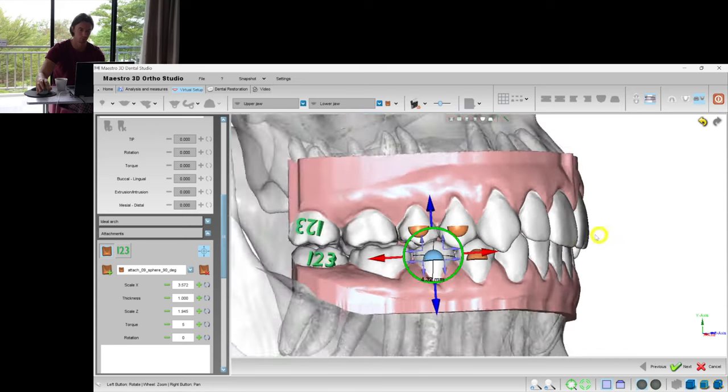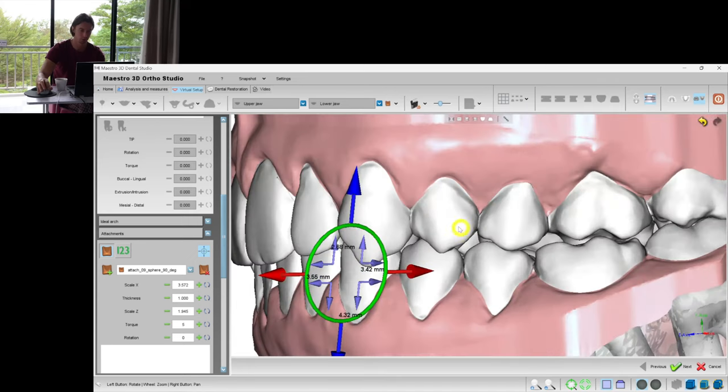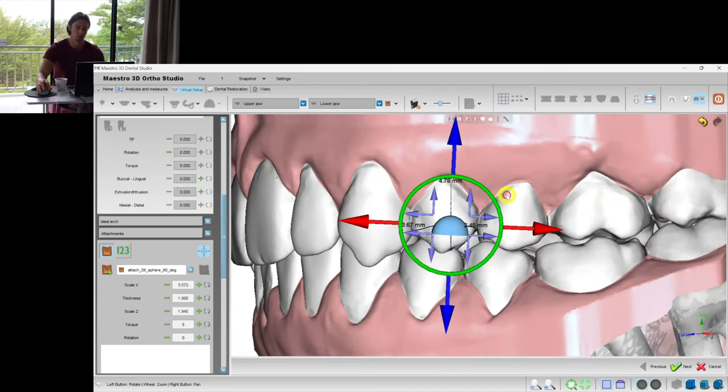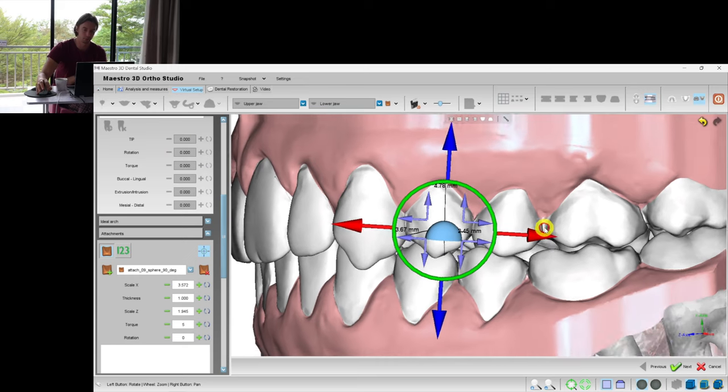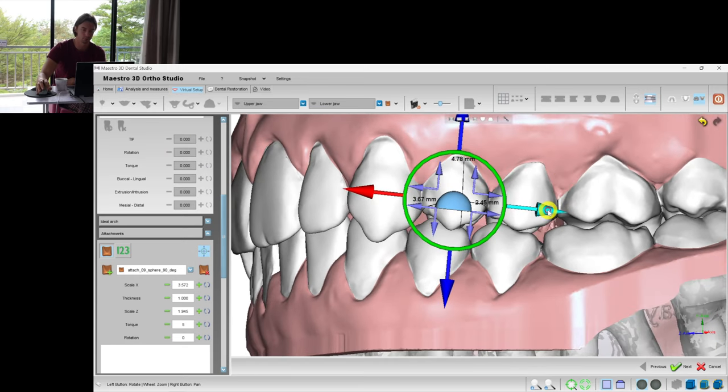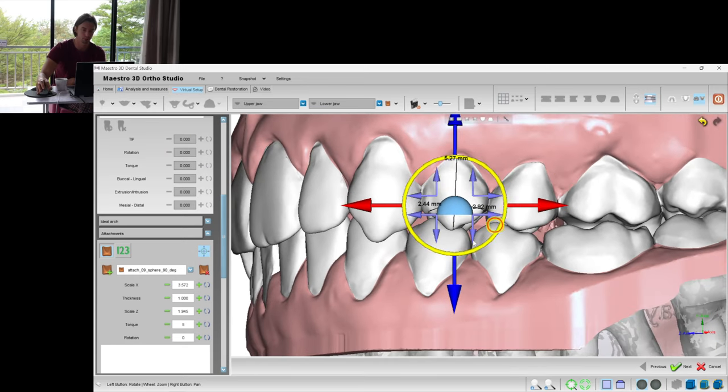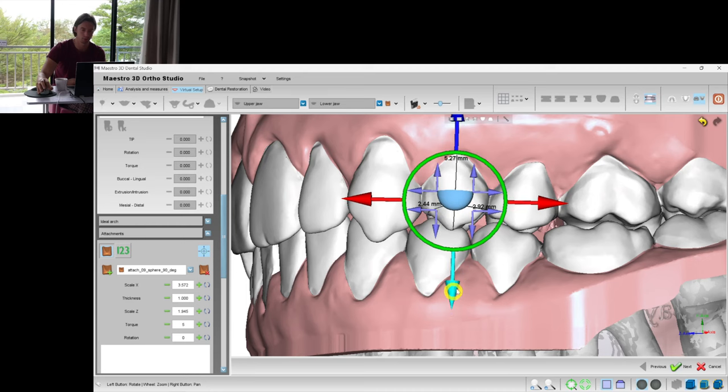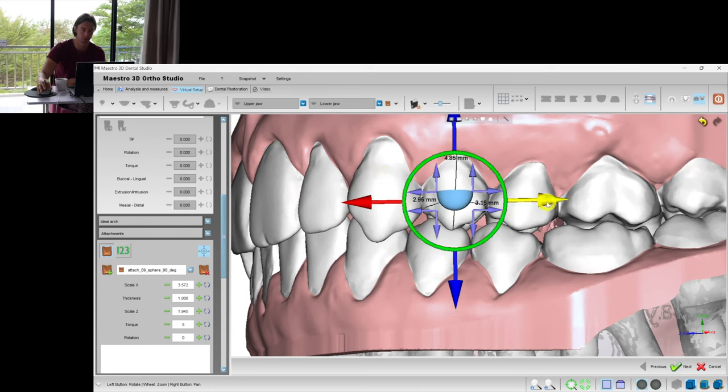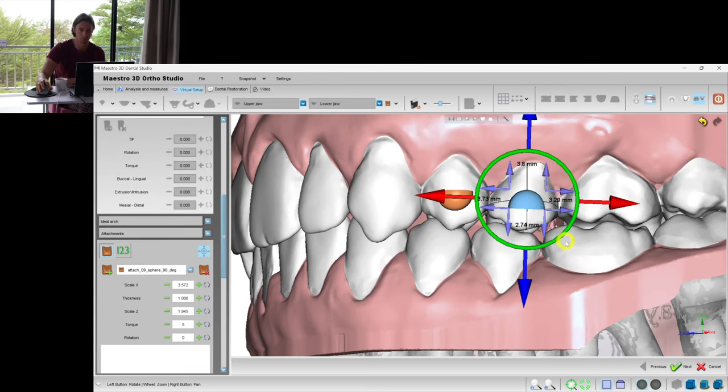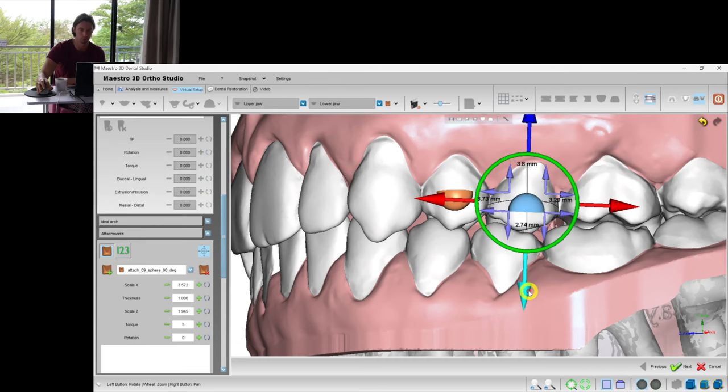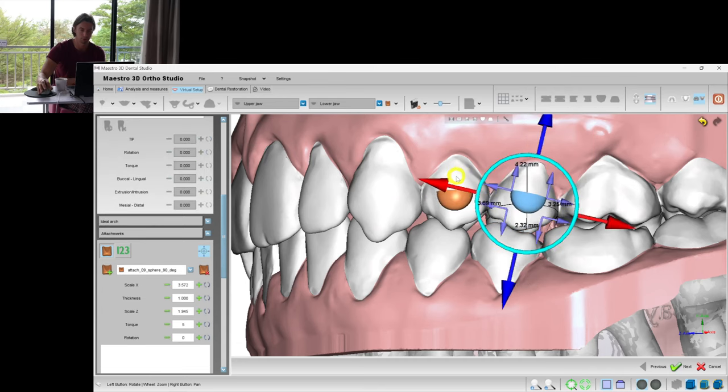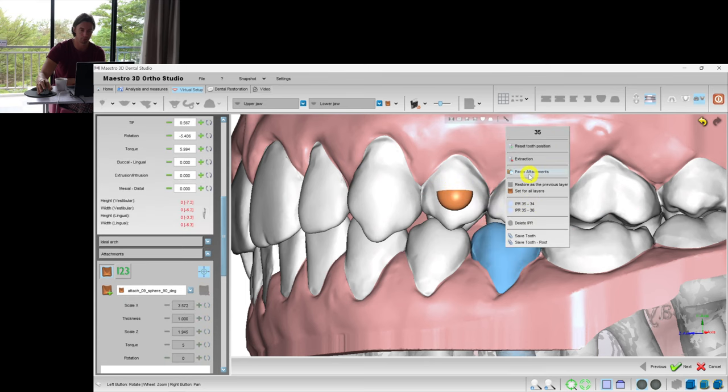And I think we can do the same for the lower arch as well. I'm not going to put attachments on the molars because I think the retention should be good. The crowns are not that small and we'll cut the aligner about the gingival zenith, like 2-3 millimeters. This also helps to have good retention.